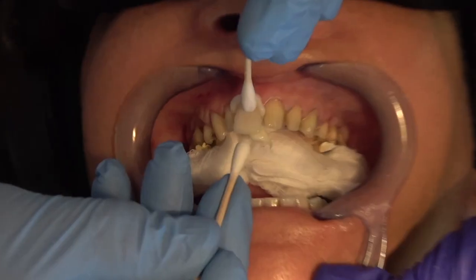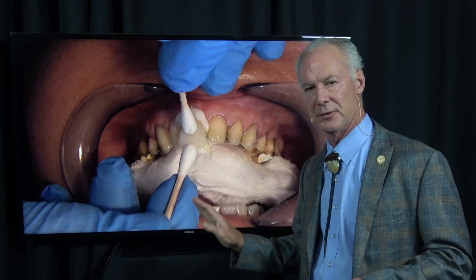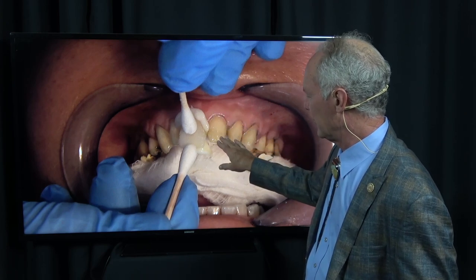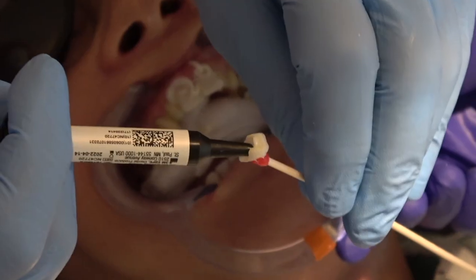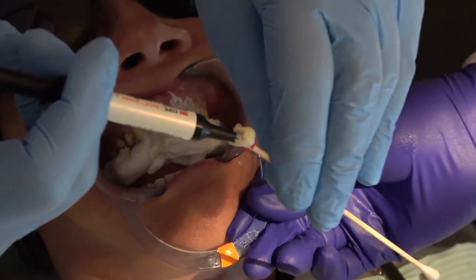Because of our preparation technique, you've got a definitive seat. If you're only prepping the facial surface and the veneer goes only on the facial surface, it will swim - there's no definitive seat and you won't seat it precisely. Because we're including the interproximal surfaces and the incisal edge, these have a definitive seat. The teeth are as strong as natural teeth after preparation - the preps are still in enamel. So I seat these with two cotton tip applicators using my carrier, keeping the tip in the luting composite.